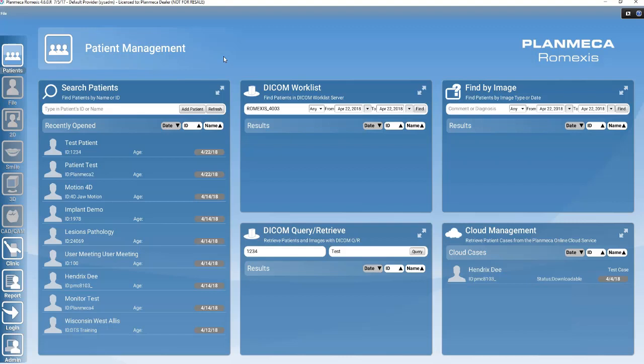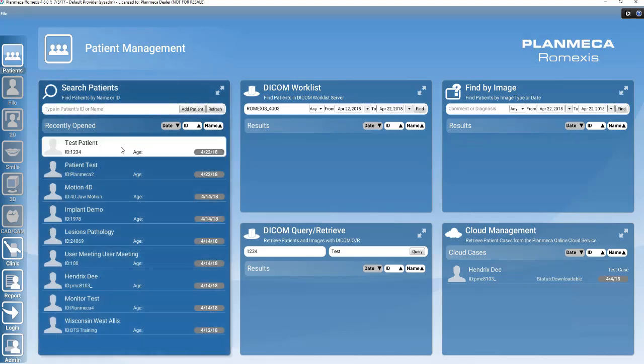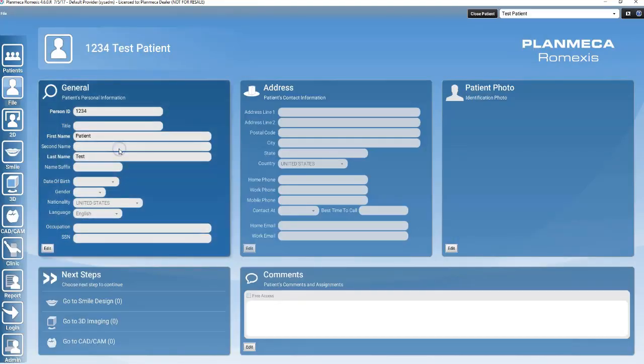Romexis allows users to import cases using an STL file format. To import a case in this format, follow these simple steps. Open up the patient's file or create a new patient file. Once the patient has been opened or created, enter the CAD-CAM module.